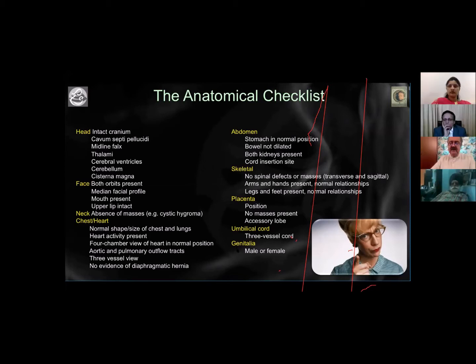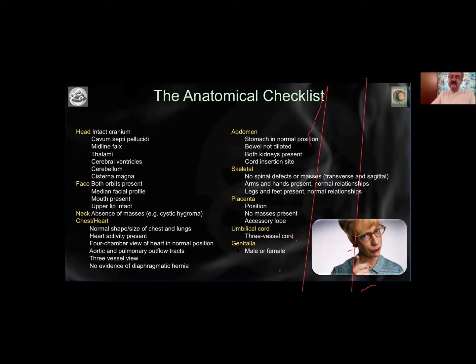The genitalia may be looked at in specific situations when you have to do problem solving, because of sex-linked conditions. These are very well known, and the PCPNDT clearly says that if it is necessary, you have to see it. So in a posterior urethral valve, I know I have to differentiate it from a urethral atresia, so I will need to look at whether the external male genitalia are well formed or not. And I may not disclose it to the patient, but it helps in my diagnosis.